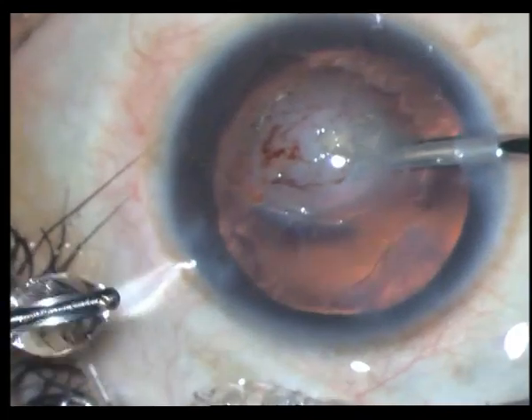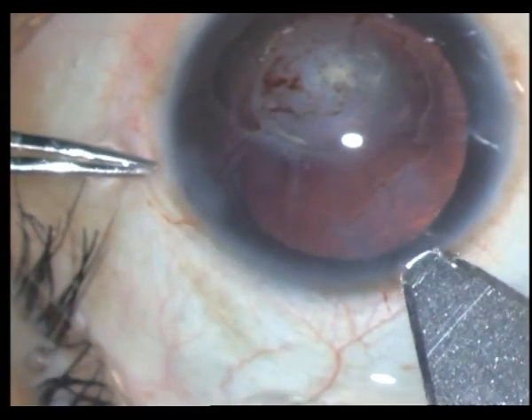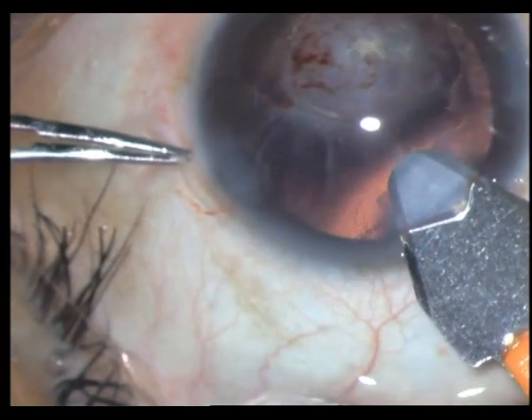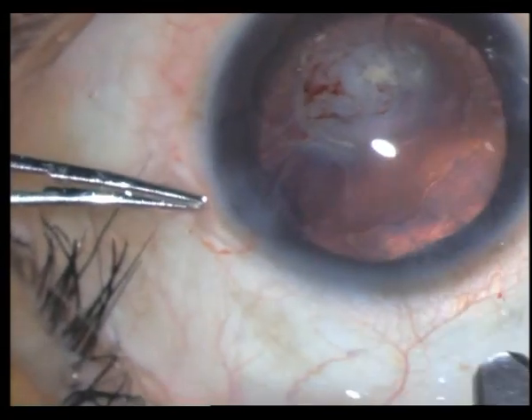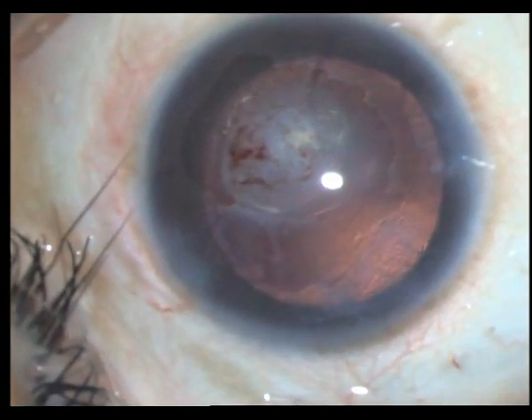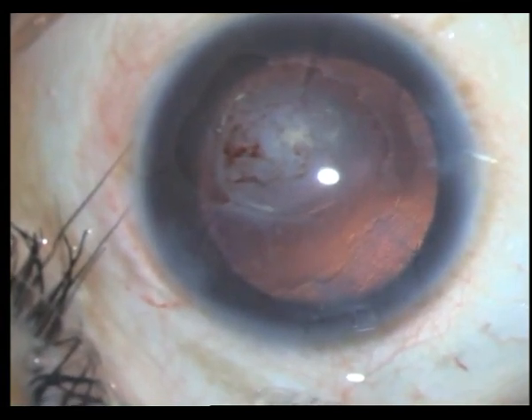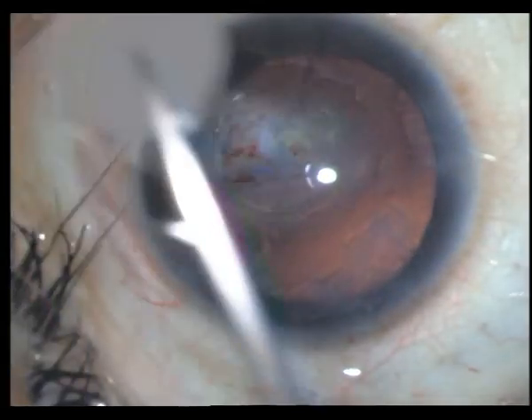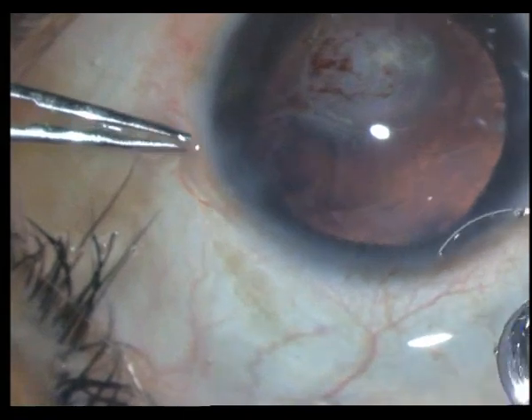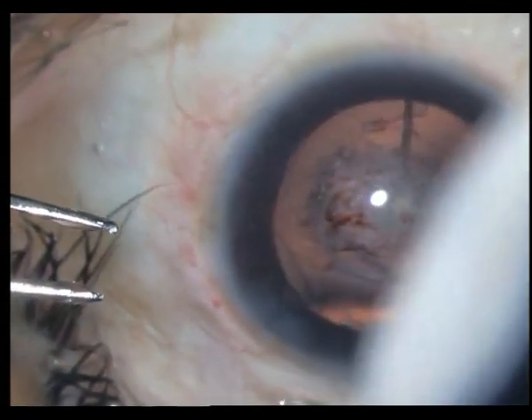Once I am satisfied — as I told you earlier — we are going to be implanting a rigid PMMA lens, a 5.2 rigid PMMA lens. Taking my 5 millimeter keratome, opening up — I have to extend a little bit because this is a 5 millimeter keratome. These 5.2 millimeter incisions seal pretty well; you don't have to suture them. However in this case I will opt to suture. Trying to make sure it goes in the bag, but this is a can-opener.